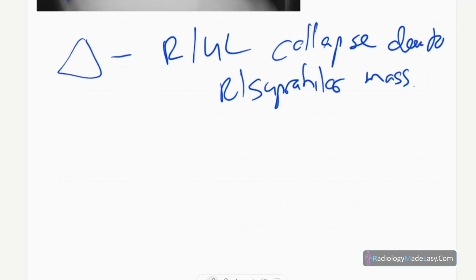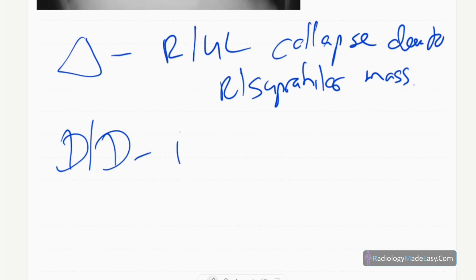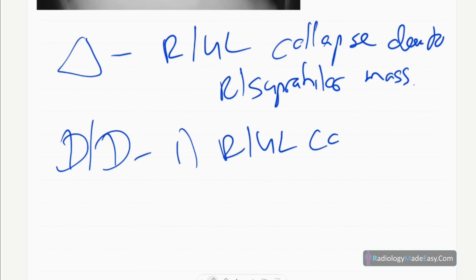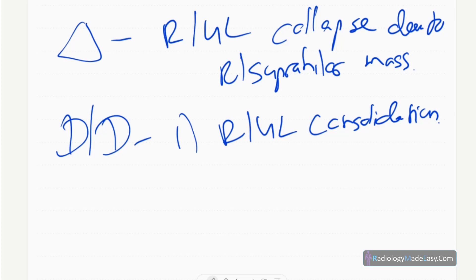The differential diagnosis in this case: first is right upper lobe consolidation. In consolidation, there will be air bronchograms and also inhomogeneous opacification; however, there is no volume loss. In collapse, there is volume loss.